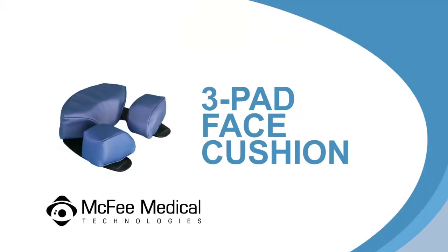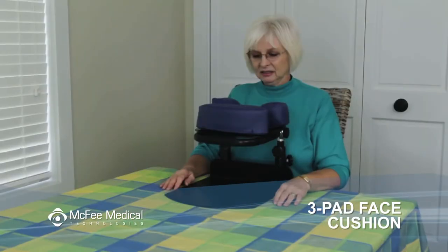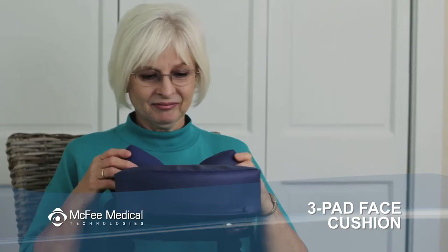The three-pad face cushion can be used in place of the crescent face cushion when wearing glasses or an eye patch, and can be used with any of our face down equipment. Remove the crescent face pad from the face rest platform and replace it with the three-pad system.